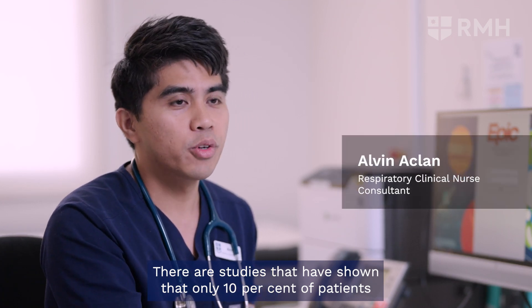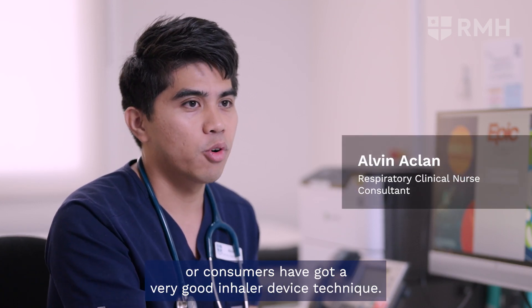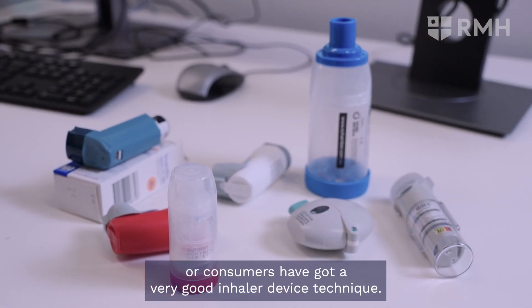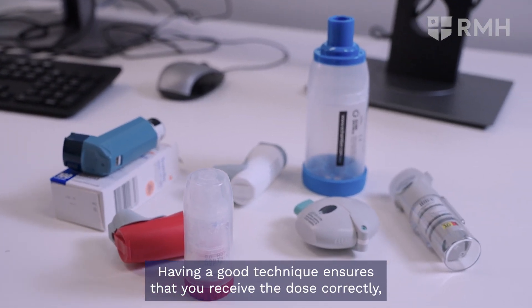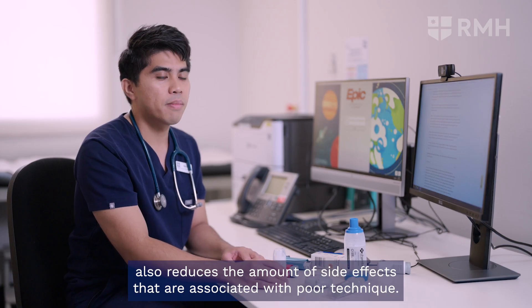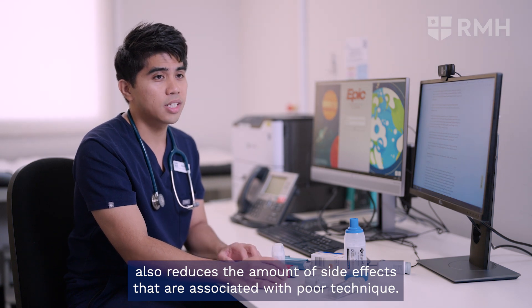Studies have shown that only 10% of patients or consumers have a very good inhaler device technique. Having a good technique ensures that you receive the dose correctly, and also reduces the amount of side effects that are associated with poor technique.